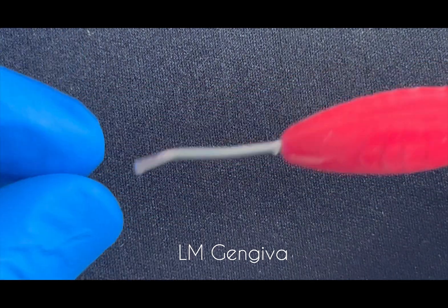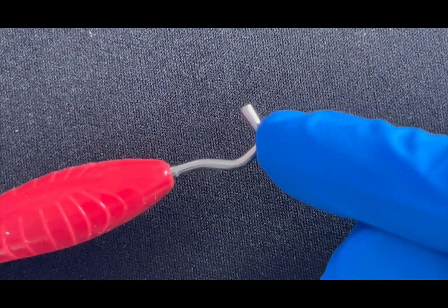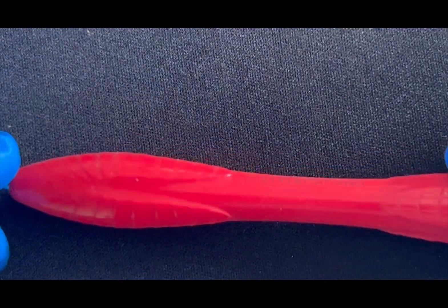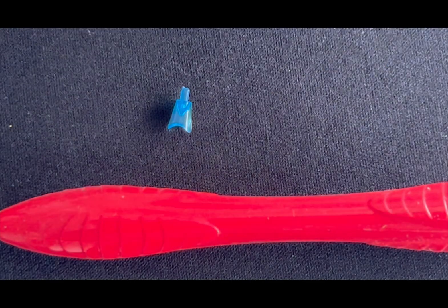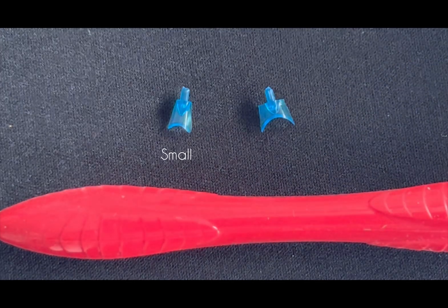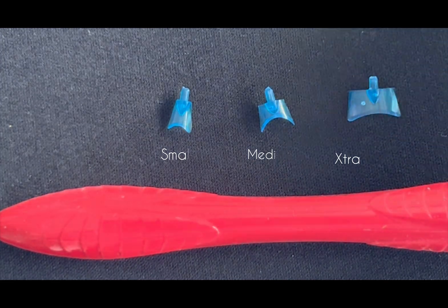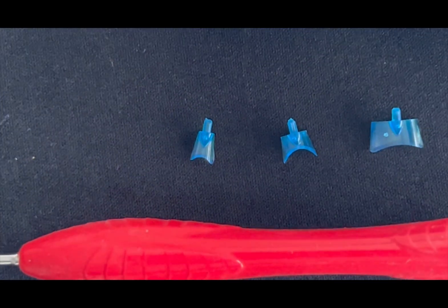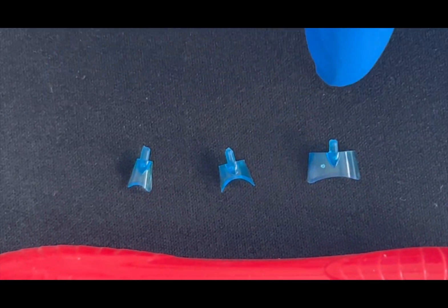It has two sides: one is single-angulated and the other is multi-angulated. It has three different tips — a small, a medium, and an extra large tip — which I use for the different sizes of the teeth.